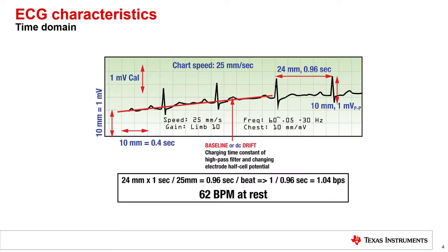Let's take a closer look at the ECG characteristics. ECG is often plotted on a special type of graph paper with a standard XY scale. 10 millimeters on the x-axis represents 0.4 seconds, which equals 25 millimeters per second. On the y-axis, 10 millimeters represents 1 millivolt. A typical ECG has a peak-to-peak amplitude of just a few millivolts when measured by an electrode on the skin surface. To calculate a patient's heart rate, the distance between two R peaks is measured and converted into beats per minute. For example, if the measured distance of one cardiac cycle is 24 millimeters, you would divide 24 millimeters by 25 millimeters per second, then take the reciprocal and multiply by 60 seconds per minute to get 62 beats per minute.